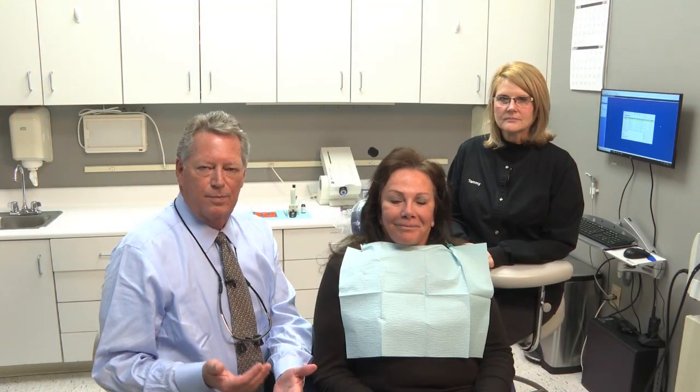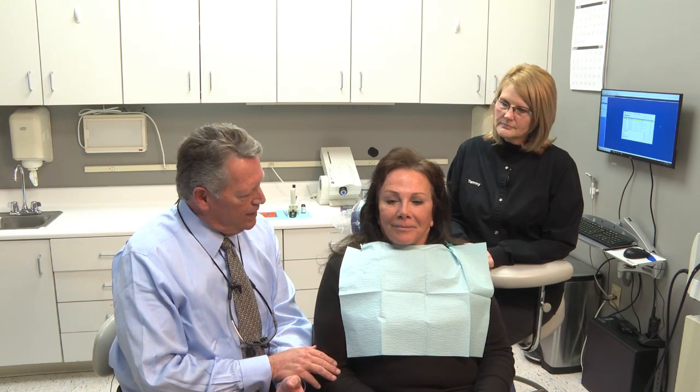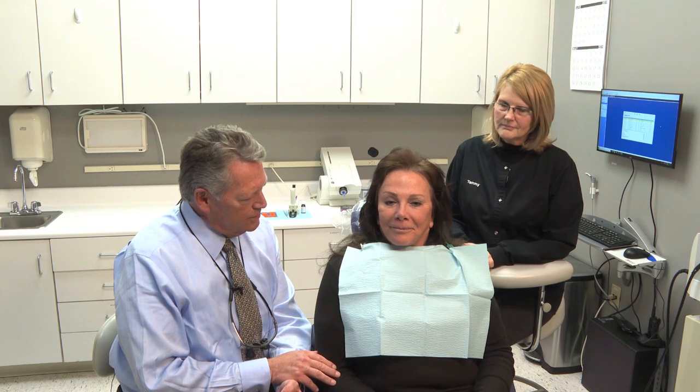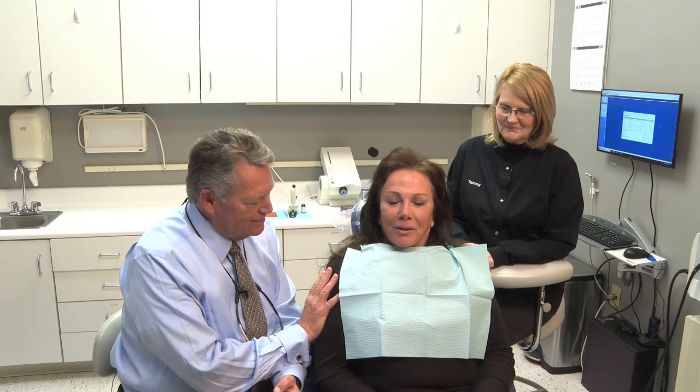So we found out the proper vertical and horizontal position for Kim's bite to mitigate her snoring using the Airway Metrics system. We found out that she didn't have any TMJ problems and that the bite was comfortable. Is that correct, Kim? Yes. So we're now ready to proceed and send the bite registration to the laboratory of your choice for the fabrication of your choice of oral appliances. So Kim, we'll get you back in a few weeks and we'll get your appliance fit properly and adjusted. We'll show you how to clean it, make sure you're comfortable with it, show you how to use the bite exerciser, and most importantly, start to get you some better sleep. Sound like a plan? Yes, thank you.